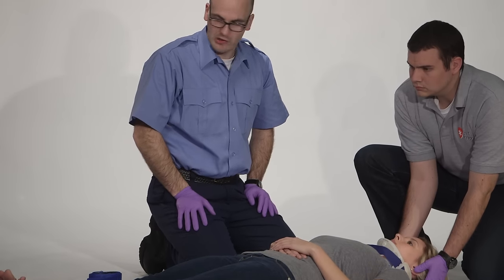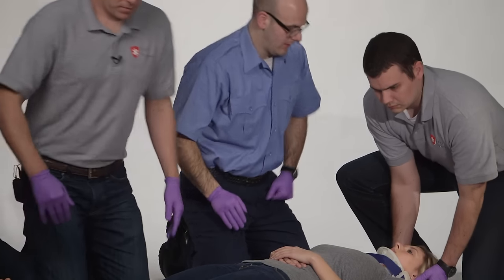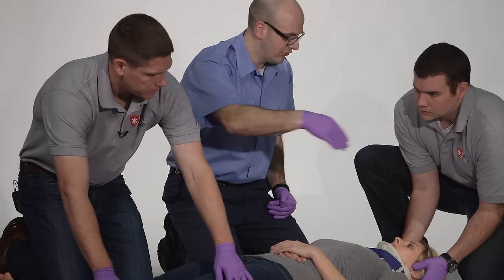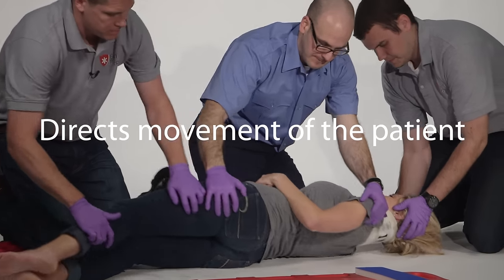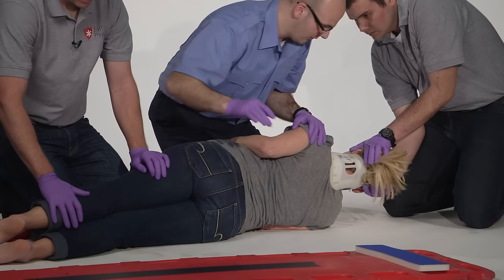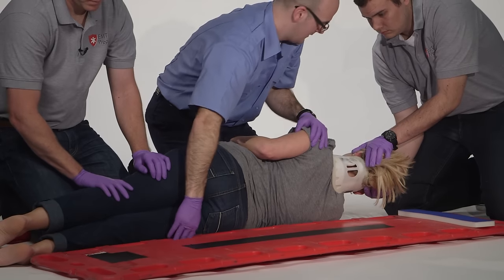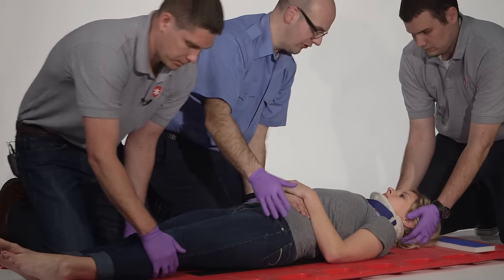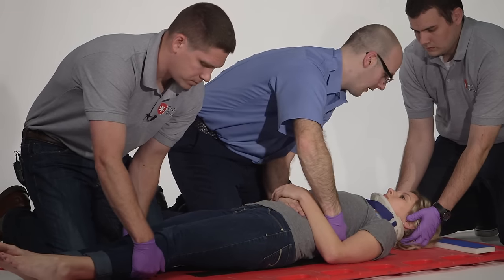The next thing we're going to do is log roll the patient and place her on the board. I'll have my other assistant come in and help. On the head's count, we're going to roll the patient towards us, then I will check her back, position the board, and then on the head's count again we will roll her flat. One, two, three. I'm going to assess the back quickly, checking for any deformity or wounds. Position the board. One, two, three. Now we're going to position her properly on the board, moving up and over in one swift motion. One, two, three. Perfect.